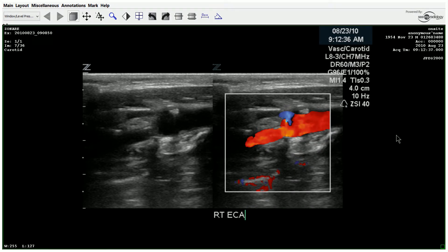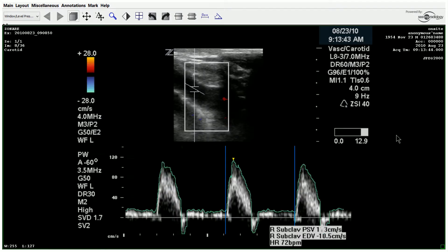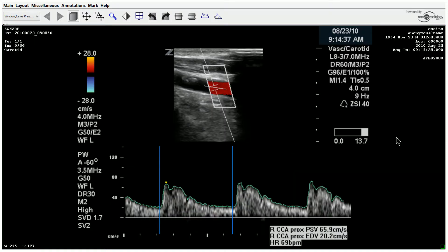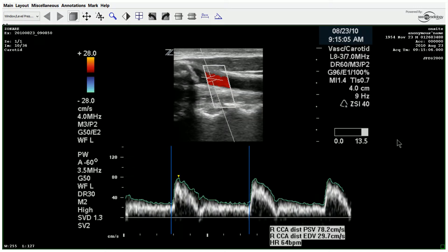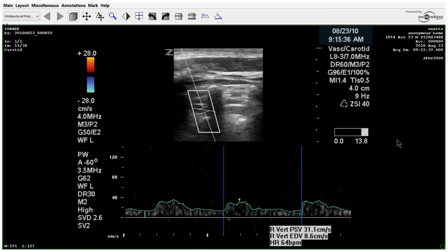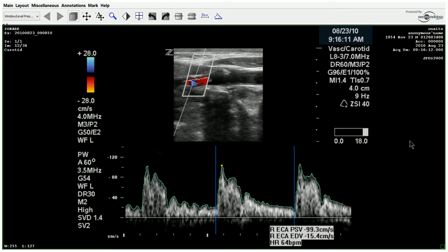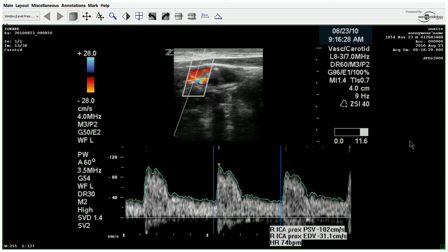Moving on to the ECA. There's the subclavian — we'll just run through. It doesn't appear to be any significant findings in the CCA. Vertebrals are antegrade. ECA looks unremarkable.